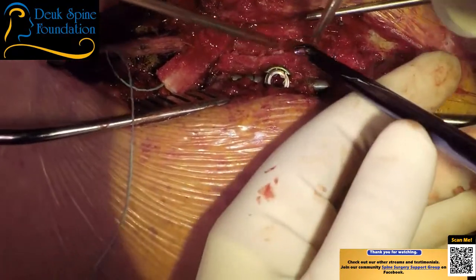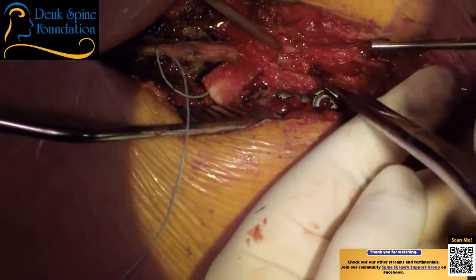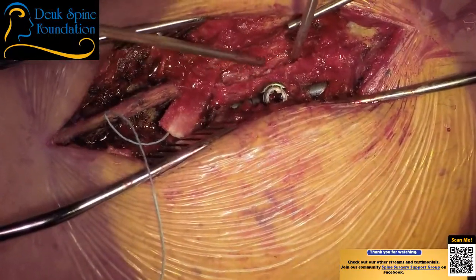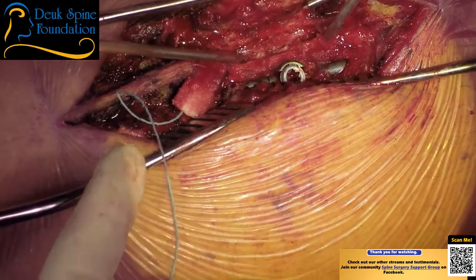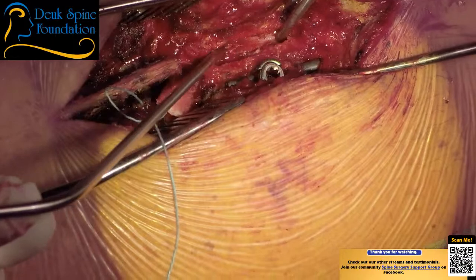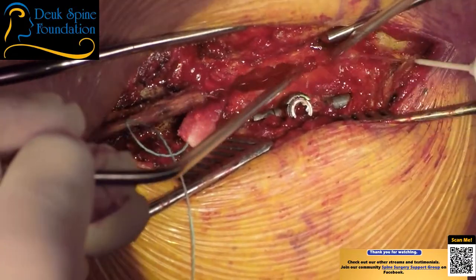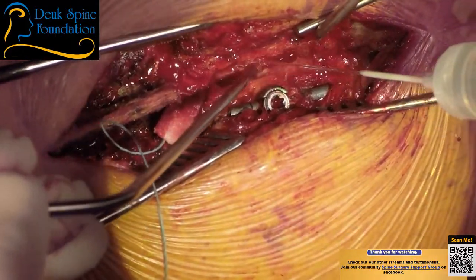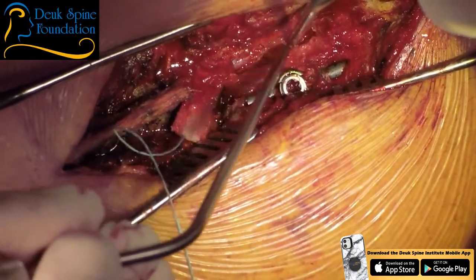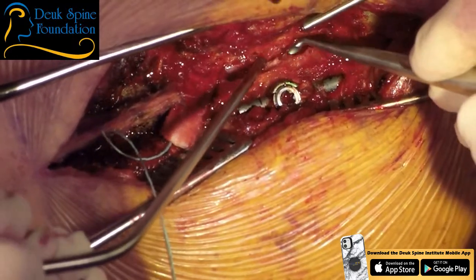Well, we're just about done. We're 95% done with the decompression. How are our waveforms looking? All right, so you got a 20 and a 40, 20%, 40%? Man, look at that cord, just red. All right, irrigation. Yeah, we're almost totally decompressed. Let me have the angled curette. I want to make sure I'm not leaving anything.